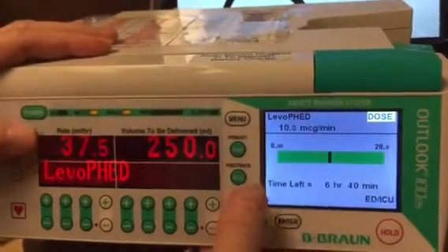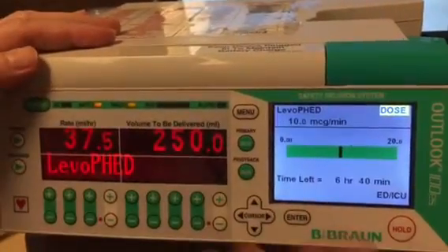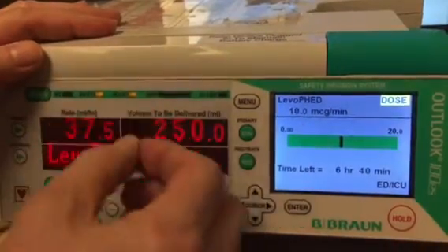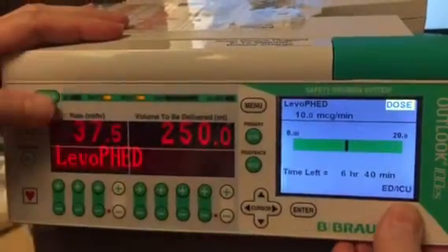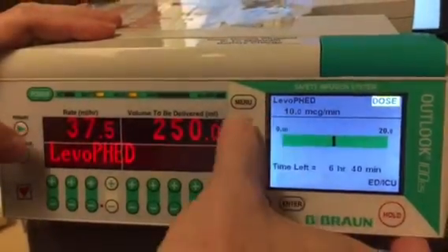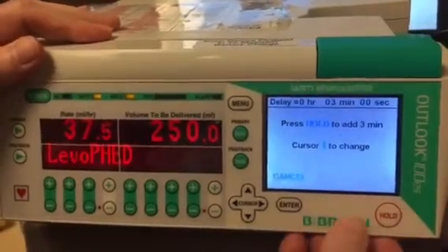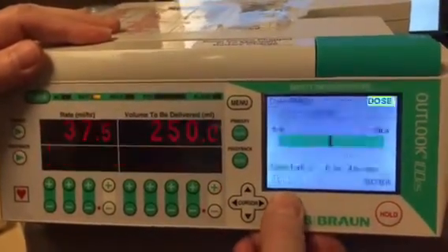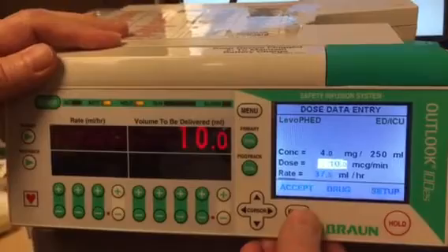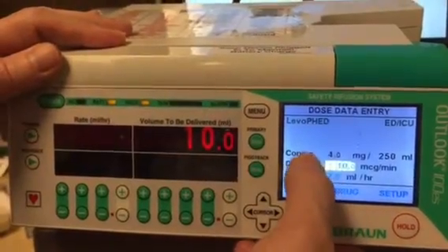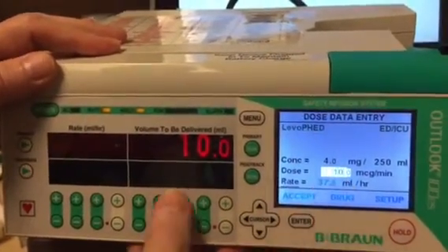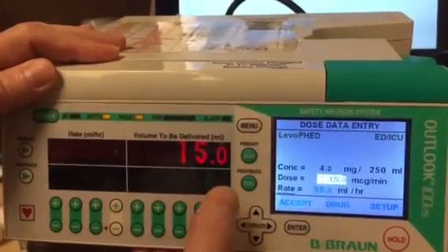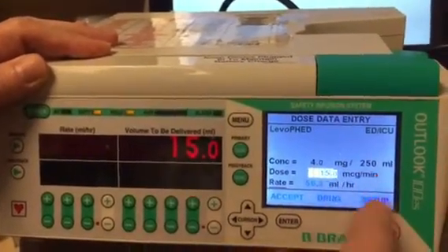It's running, and the doctor wants to increase it to 15 mics per minute. The way you get back to the setup page is you put it on hold. You put it on hold, and then you hit the enter button twice. Hitting it the second time will bring you into the setup page where you can now adjust the mics per minute.